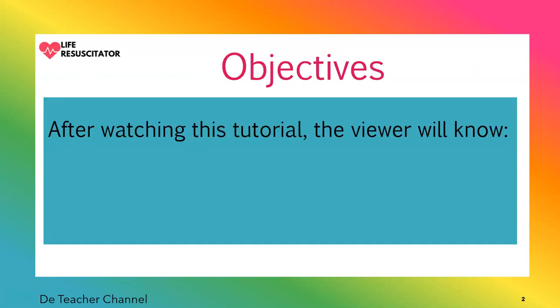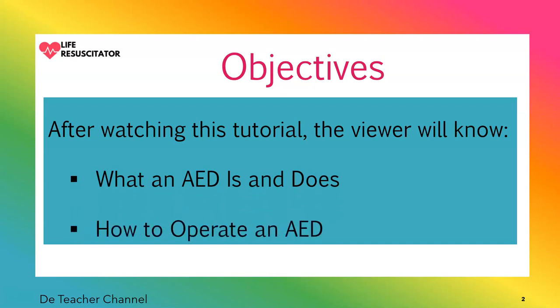So what are the objectives? There are two of them. After watching this tutorial, the viewer will know what an AED is and does, and how to operate an AED. Two simple objectives.